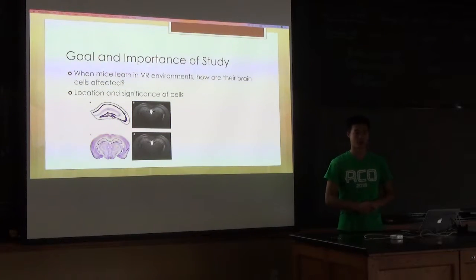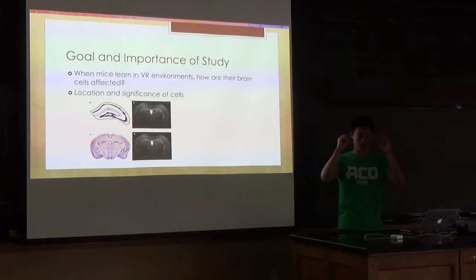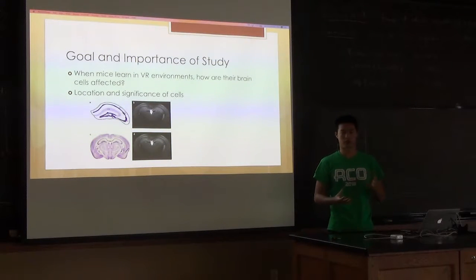This is so that we can do those experiments that require the head to be fixed. If we put them in a real environment, they're going to have to wander around, and then we can't keep their head still, and as a result, we can't image. Okay.